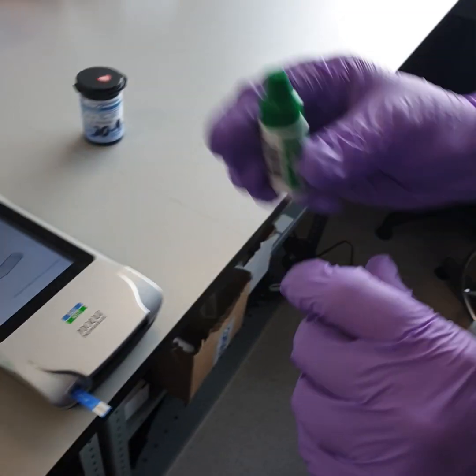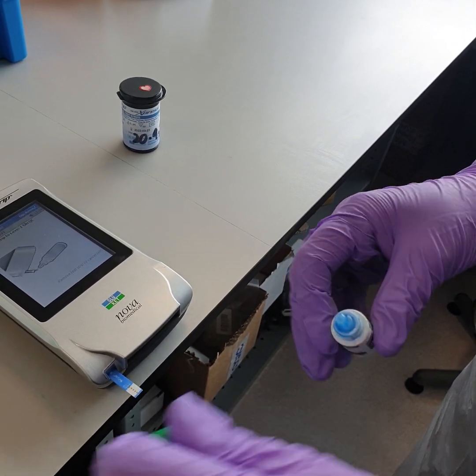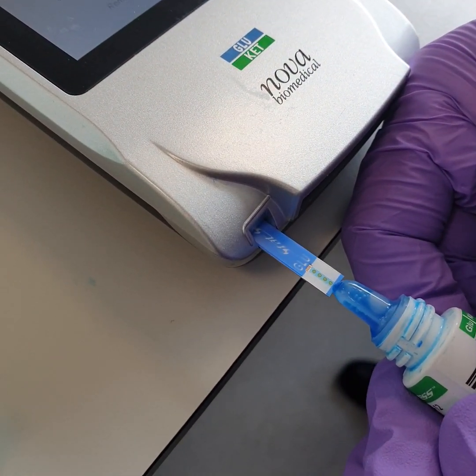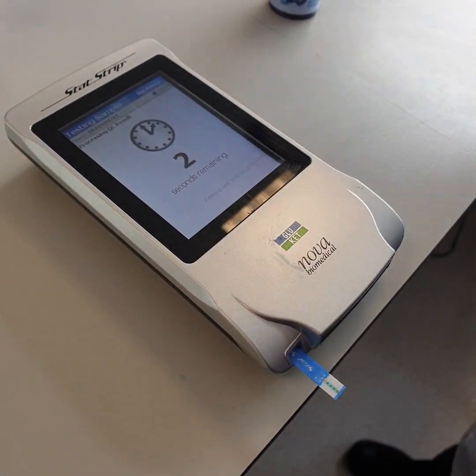Invert the bottle to mix the solution, then gently squeeze the bottle to produce a hanging drop without an air bubble. Test by making the strip come into contact with the drop. The testing takes six seconds.